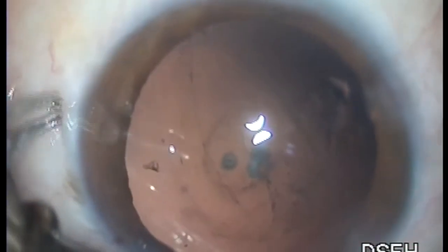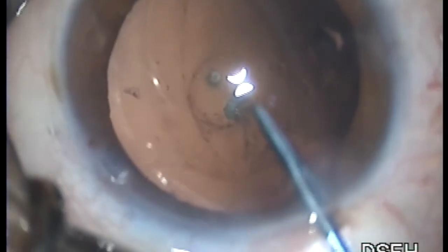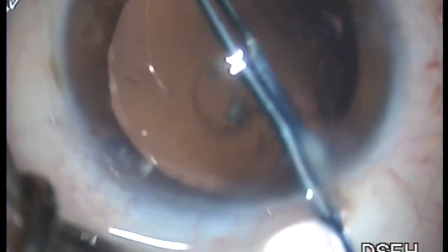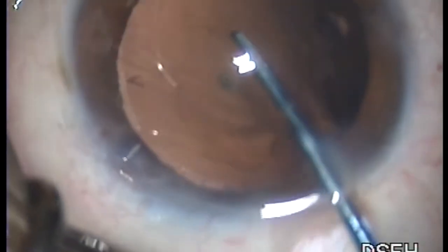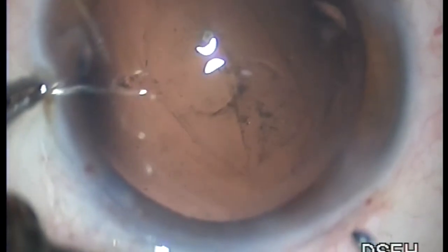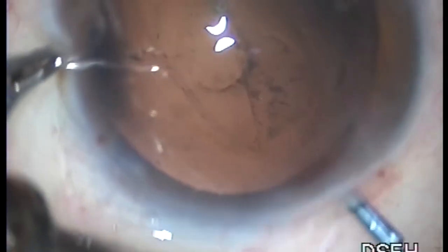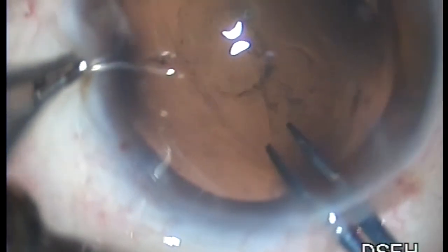We see a rupture — an opening — in the posterior capsule. Hold the posterior capsule and pull it to create a long capsulotomy parallel to the anterior capsulotomy.